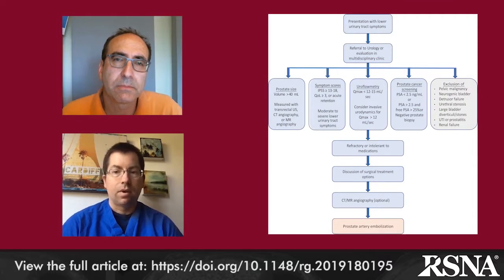Great, well, thanks for that. So moving on to the main focus of your paper, let's discuss the use of PAE in this particular setting. The section on indications for embolization is accompanied by a flow chart, which is Appendix B. We'll put that chart up as you review the process by which interventional radiology assesses patients for possible prostate artery embolization. The indications for embolization are evolving as we learn more about the procedure.